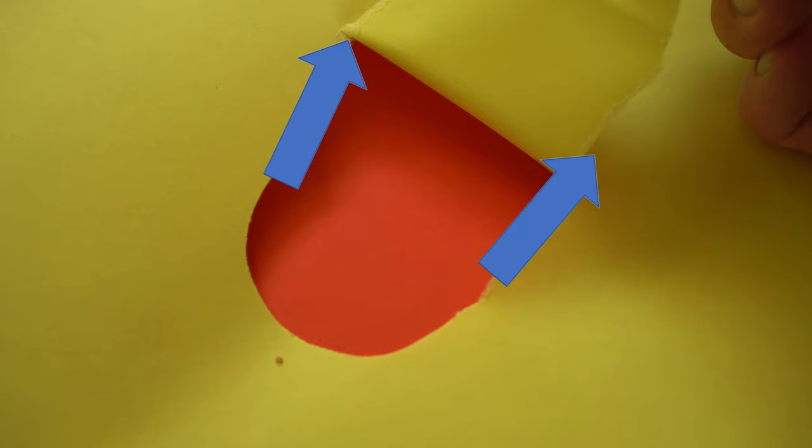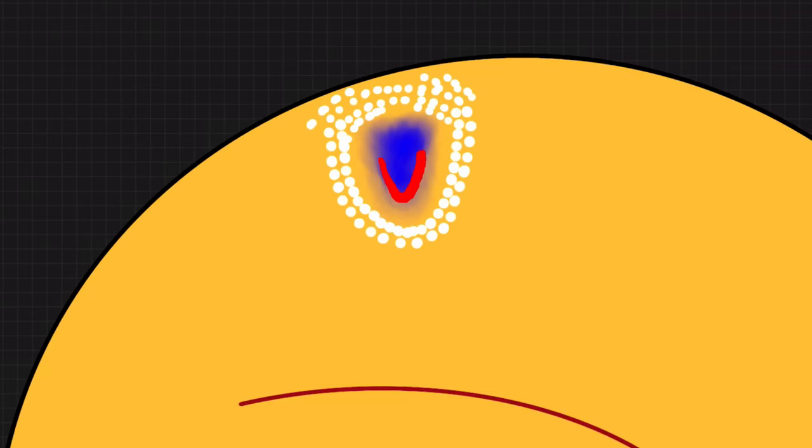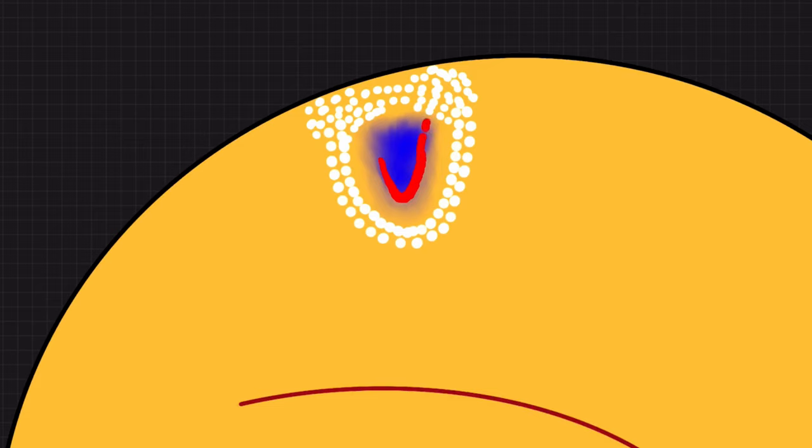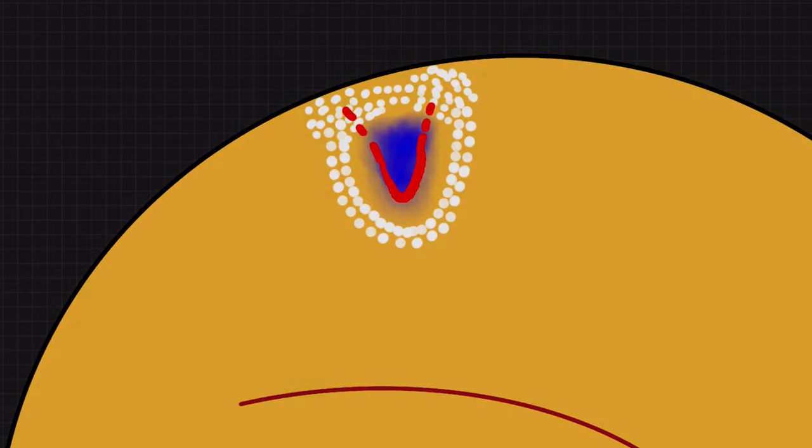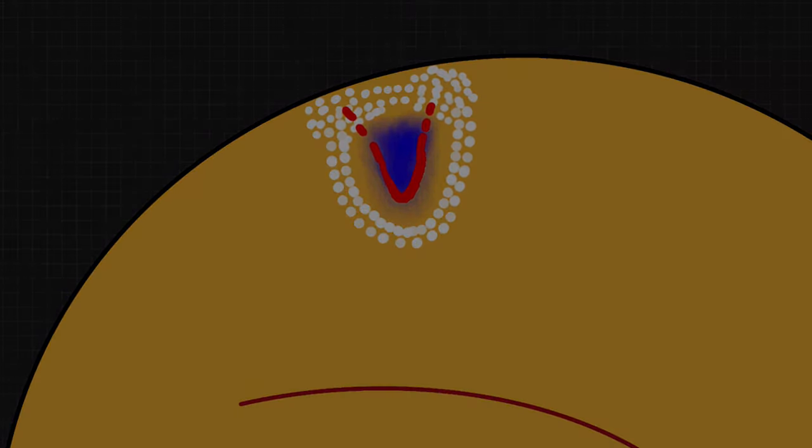Now you need to focus on those tear lines. Put as many spots as you can in the projection of the already existing tear lines. But if you've set enough spots there, the vitreous can pull as hard as it wants—it won't be able to enlarge the tear. As a last little tip, the scars need at least two weeks to form, so you should monitor the patient closely during this time.